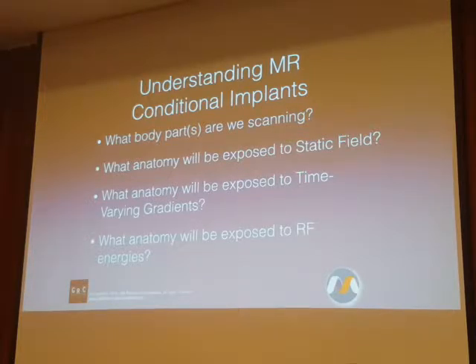The retainer magnet that's embedded in their scalp, in their skull, the force that's trying to twist or flip that can be extremely painful to patients who have the cochlear implant, the retainer magnet. So it says, even if you follow all of our instructions, it may be so painful the patient can't proceed.